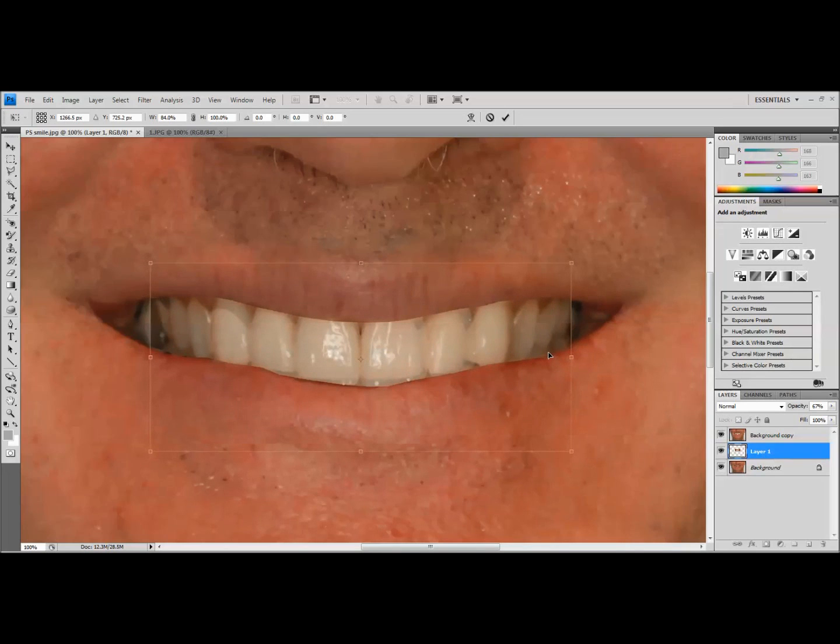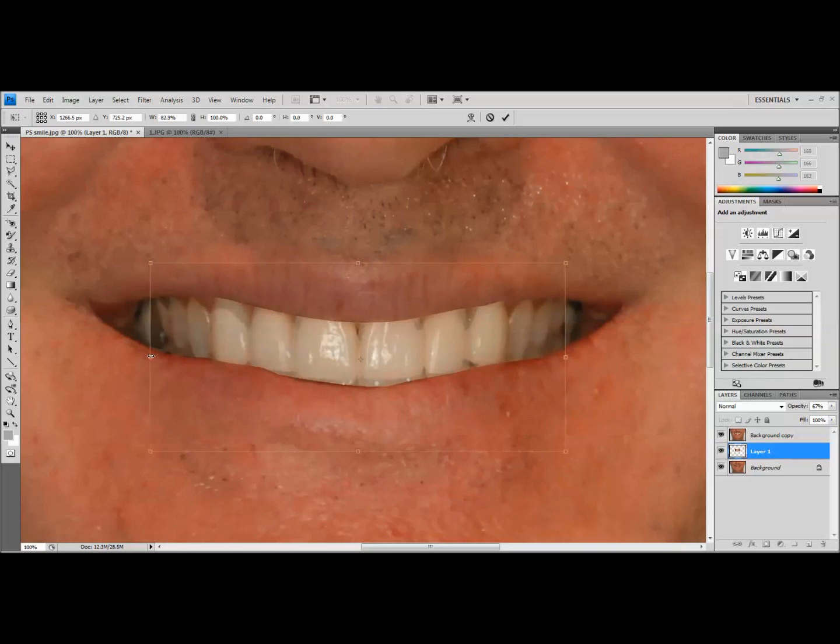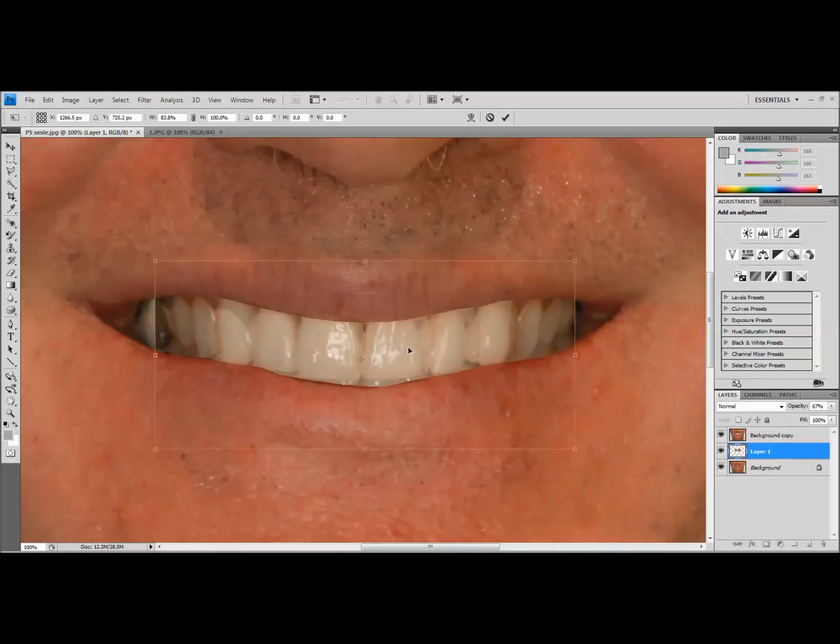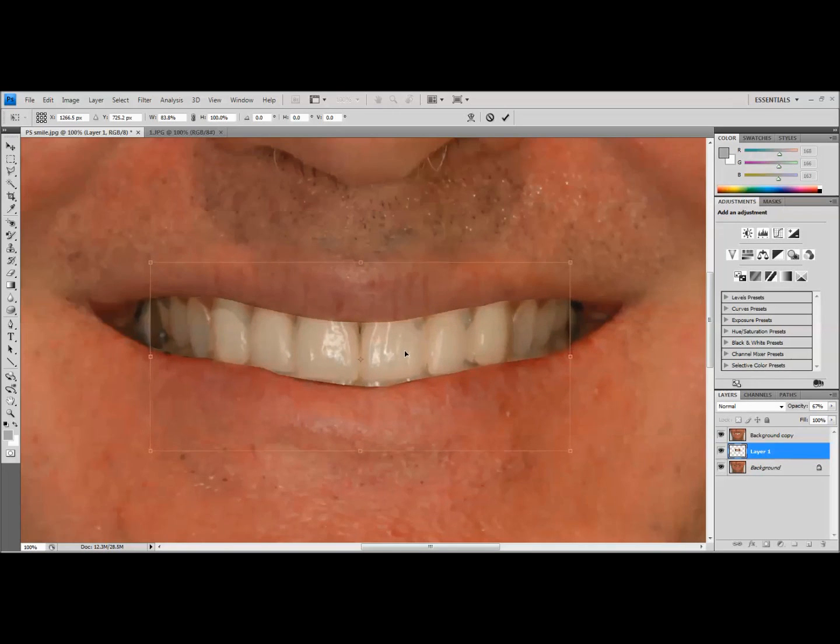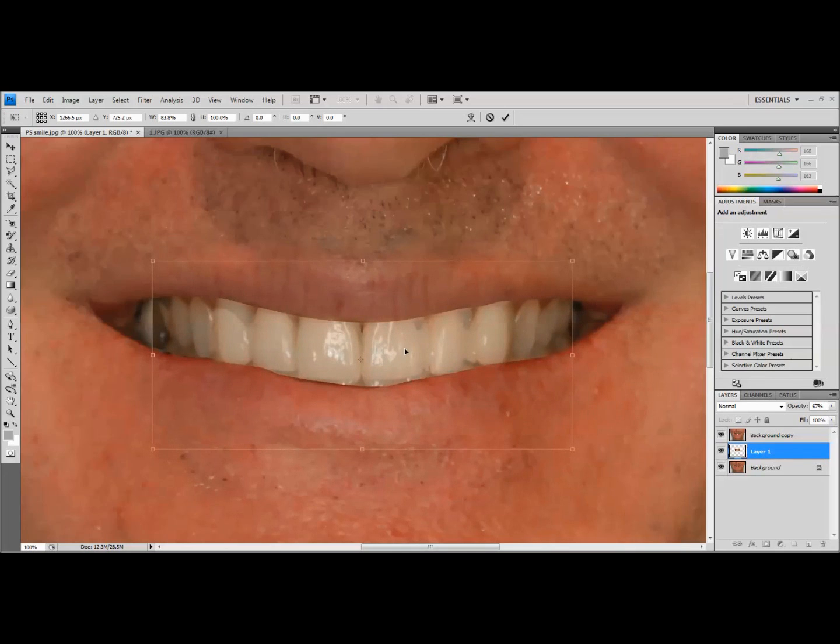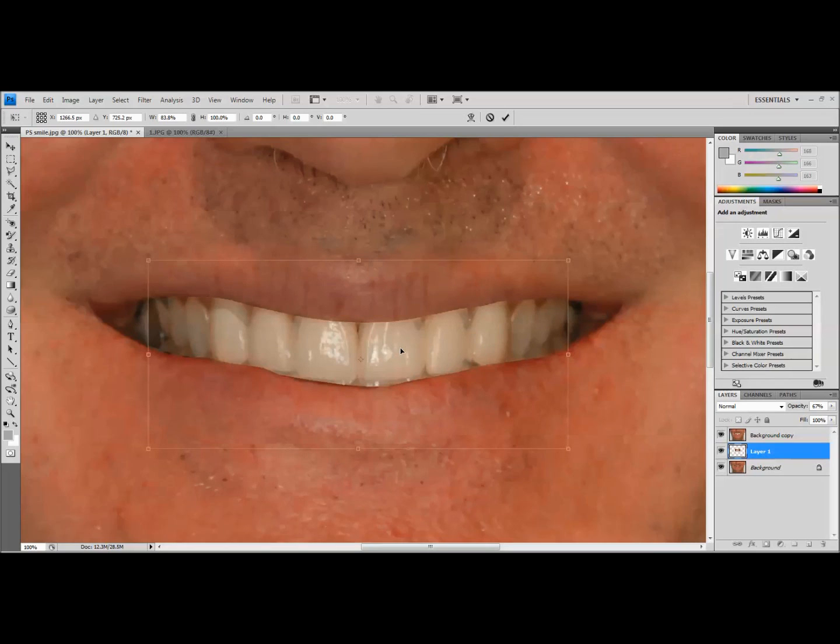This one is still a little bit wide. So I'm going to bring it in slightly narrower. And now you can see we're getting really close. I may have overdone it. So I'm going to widen it back out. The reason I'm saying that is because if you look at the canine here, the patient's canine on the bottom layer looks a little wider. And so this won't be exact, but we're pretty close now. And so again, I'm going to line this up where the teeth should ideally follow the lower lip line, just like you would go for in a standard aesthetic smile design. You don't have to line this up perfectly, but you want to get pretty close as far as the tooth alignment.